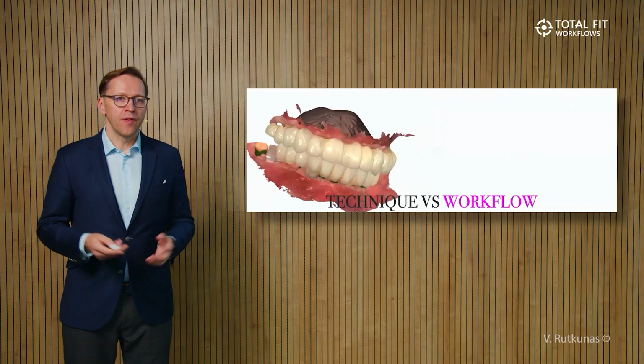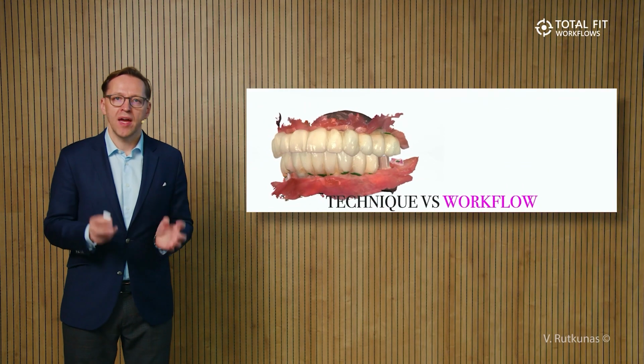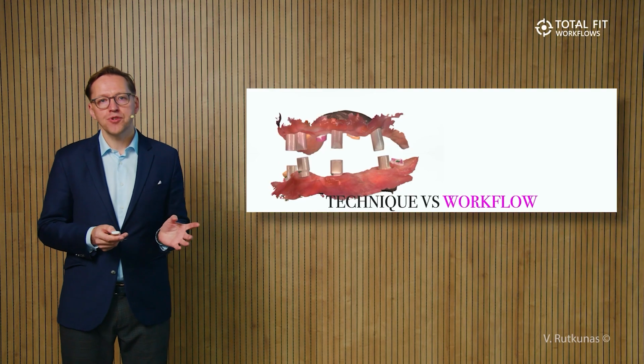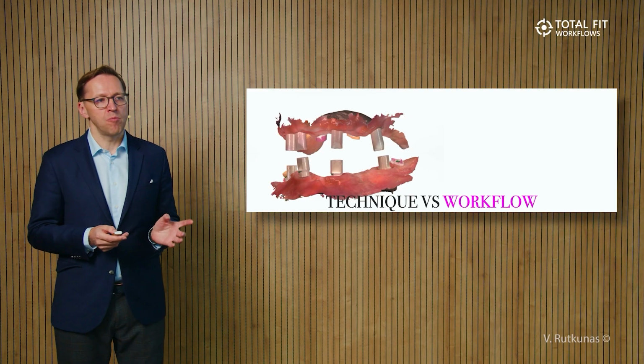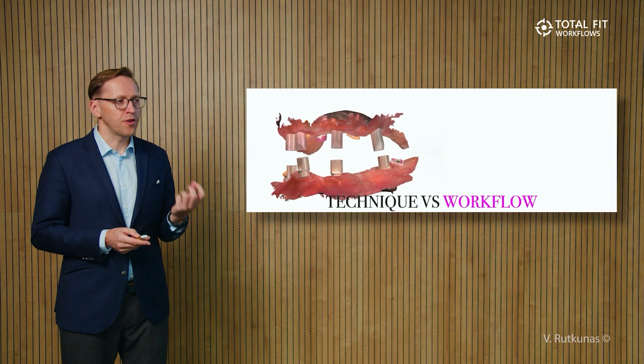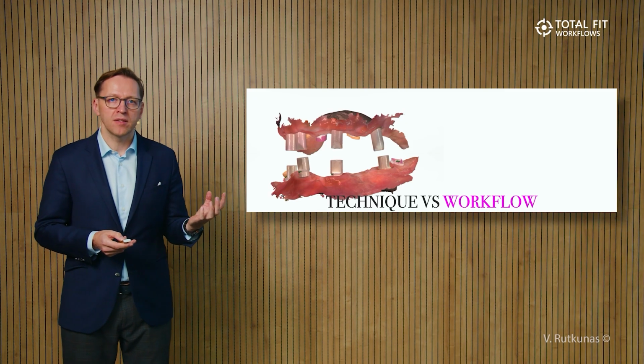Another challenge in the digital workflow is that we have quite many well-working techniques. For example, capturing the position of scan bodies. I think we made great progress with that. However, it's not enough, because in clinical practice we are not only capturing implant scan body positions, but also registering the bite.